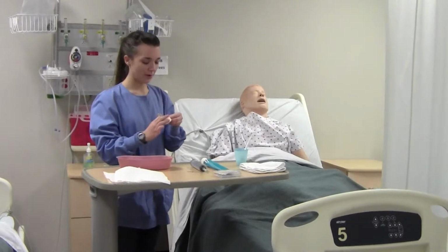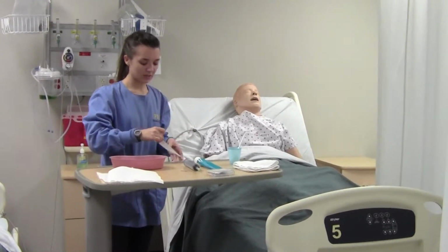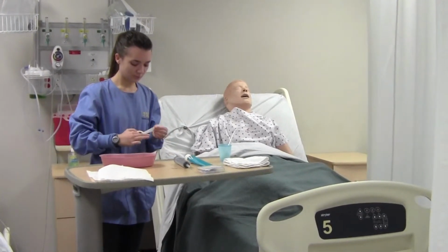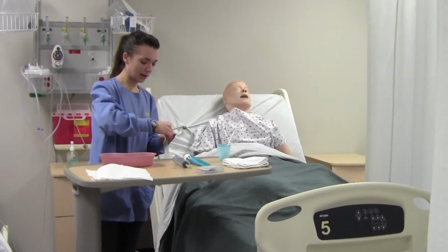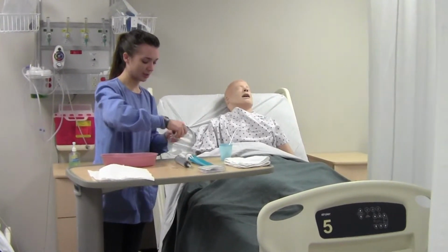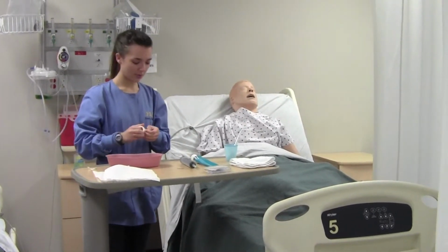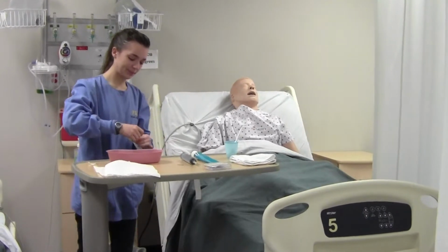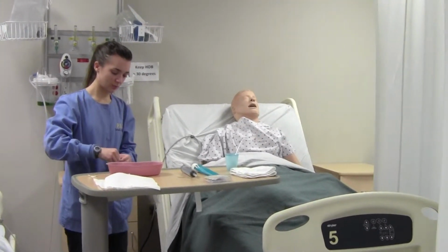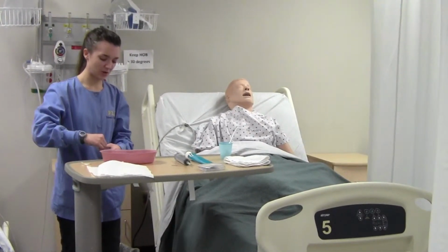I'm actually going to prep our tape. We're going to have one small, one large. It's actually pretty long. I'm going to shorten that just a little bit. There we go. Put that to the side, and we're going to have two medium. And your lube can get kind of messy, so I always like to do one extra one just in case.